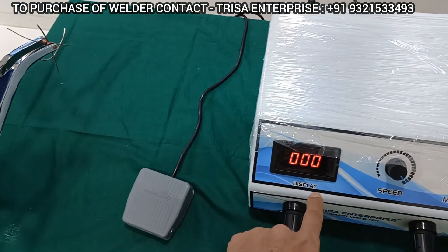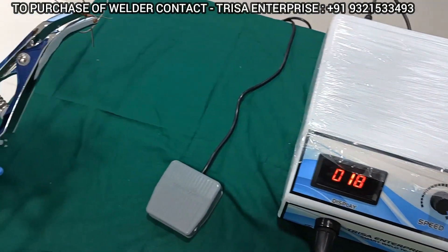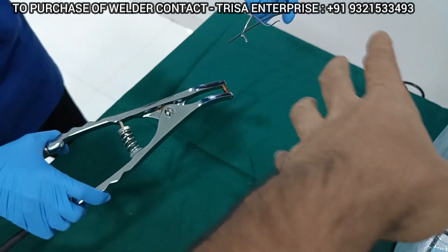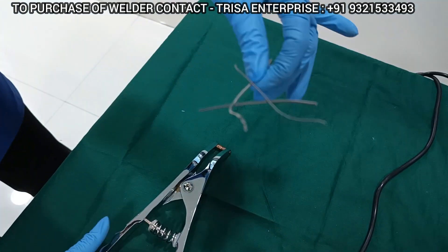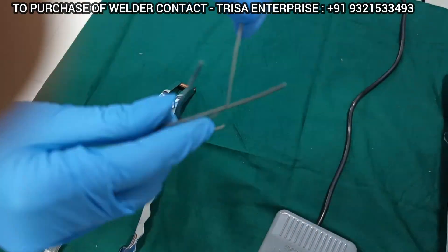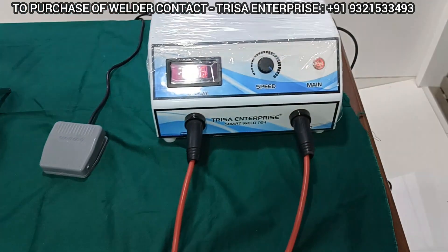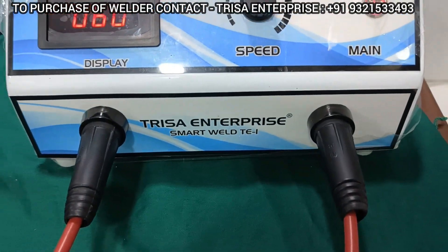So make sure you have released your hand completely, and then whenever you are ready, you can press the foot control. The moment you press the foot control, you see the zero over here and now the machine has started to recharge. You can even check the amazing bonding between the wires with this instrument from Trisa Enterprise, the Smart Weld TE1.